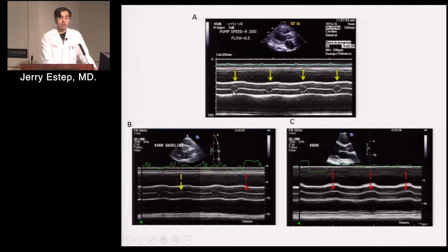So the aortic valve can be seen by 2D or M mode, and it's very easy to appreciate. While there is, compared to a normal patient with normal ventricular function, a reduction in how long the aortic valve remains open, right? Typically in excess of maybe 250 milliseconds. Here, open with every beat after ventricular systole. This particular patient persistently closed, right? And that's intermittent here, closed here. So when you're feeling for a pulse, the clinical correlate to this is when you're feeling for a pulse, you want to feel for some time, 5 to 15 seconds.